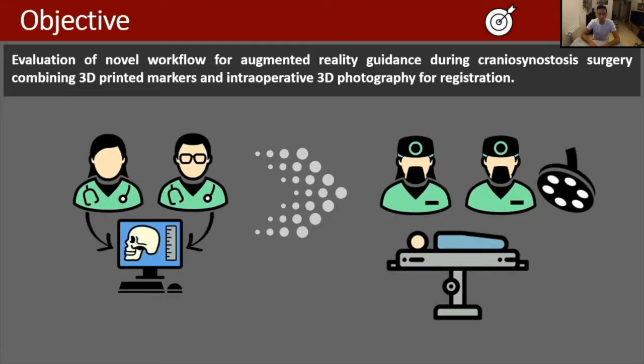Therefore, the objective of this study is to evaluate a novel workflow for augmented reality guidance during craniosynostosis surgery. This workflow is based on combining 3D printed markers with intraoperative 3D photograph.